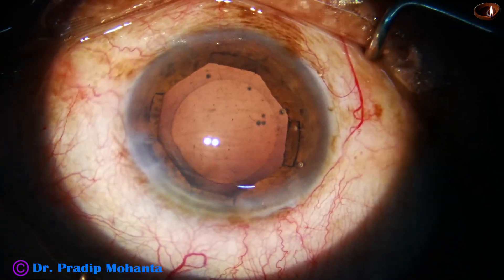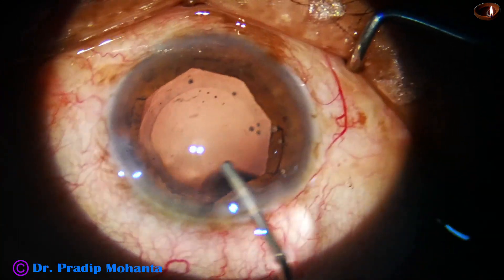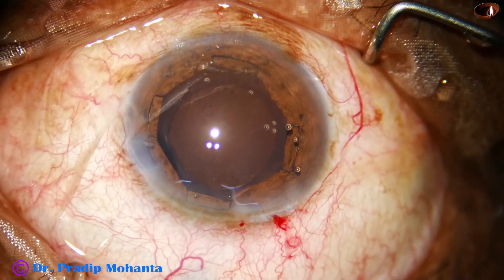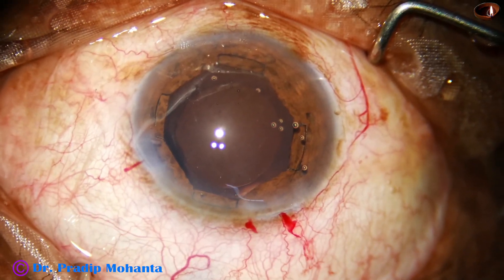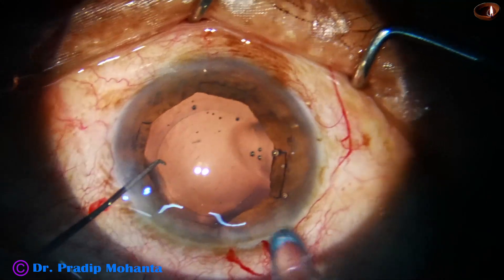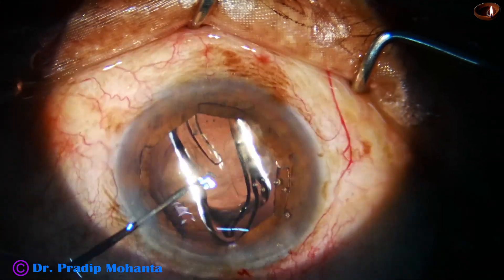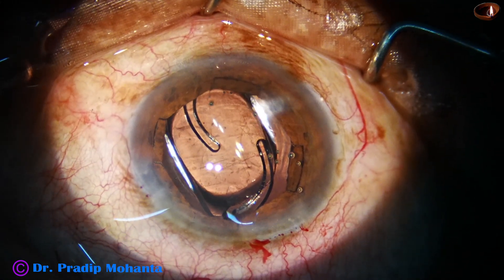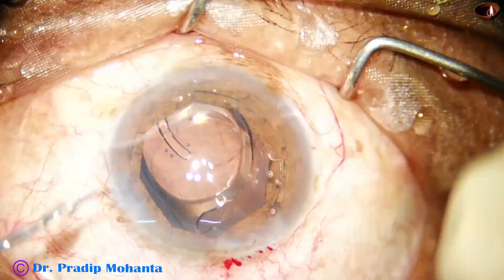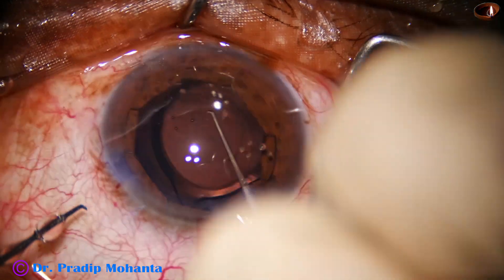Now we are going to implant an intraocular lens. Viscoelastic is used to fill up the anterior chamber and the capsular bag. The main wound is enlarged a little bit — just by one cut — so that delivery of the intraocular lens is effortless and the lens doesn't get stuck at the wound. This is a nice hydrophobic lens. The lens goes in the capsular bag. We place the lens so we can go behind it and remove the visco. Haptics are placed 90 degrees away from the main wound.